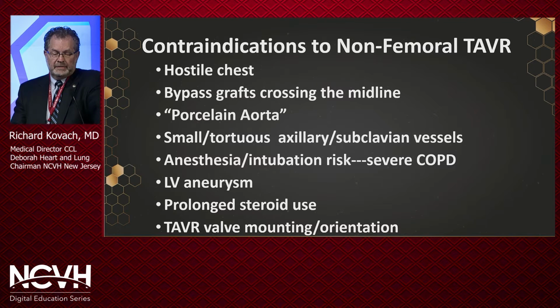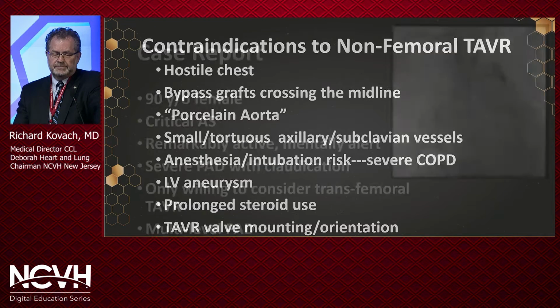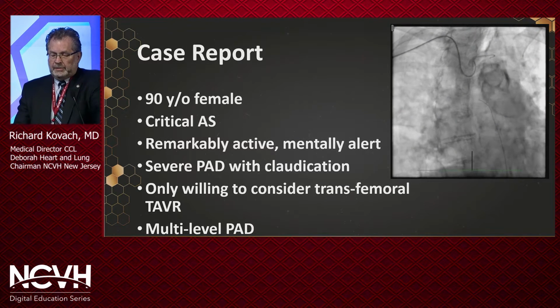Contraindications to non-femoral TAVR: hostile chest, bypass grafts, porcelain aorta, small tortuous axillary or subclavian approach vessels, anesthesia and intubation risk, LV aneurysms, etc. So we'll start out with a case report here.